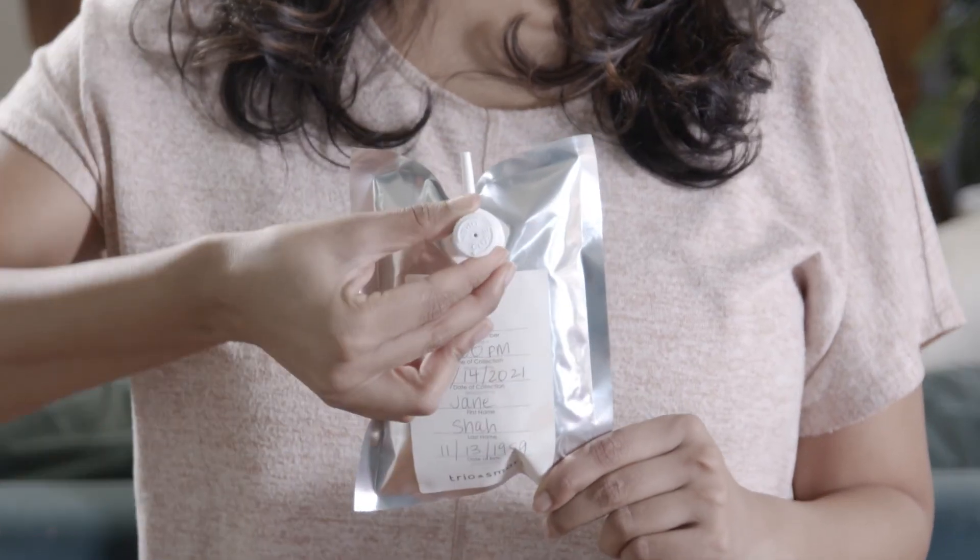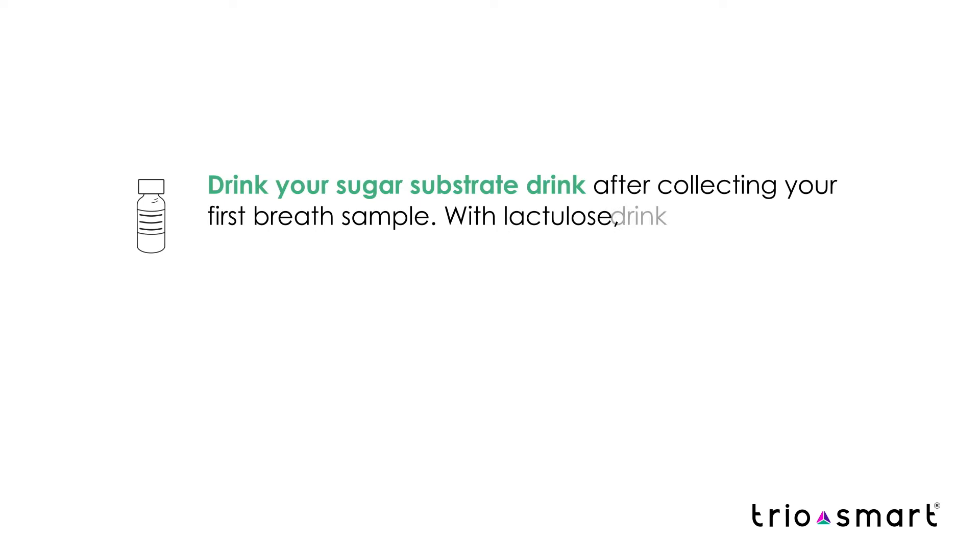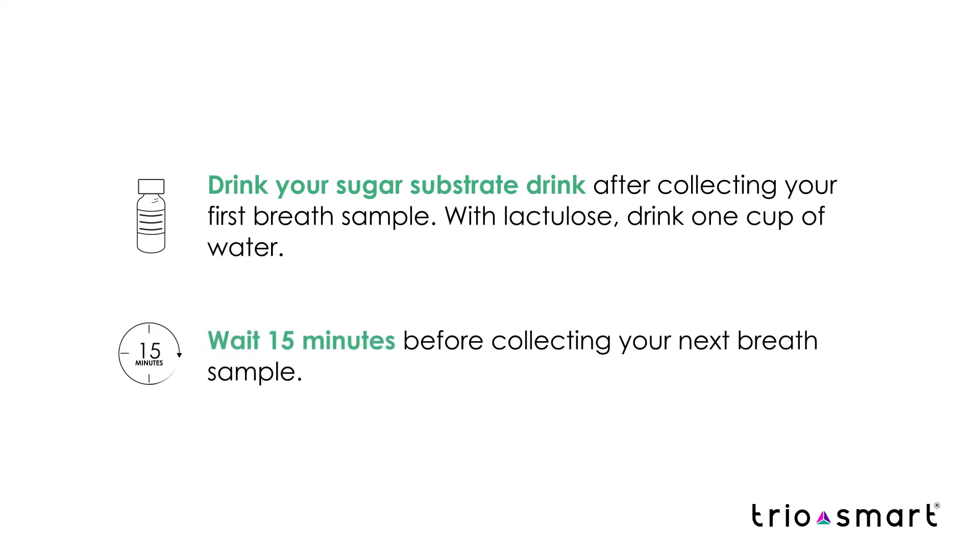Now remove the mouthpiece from the valve and turn the cap clockwise to close. After collecting your first sample, drink the full dose of the sugar substrate drink — glucose or lactulose. Then wait 15 minutes before collecting your next sample.